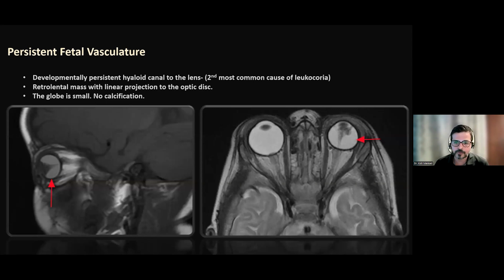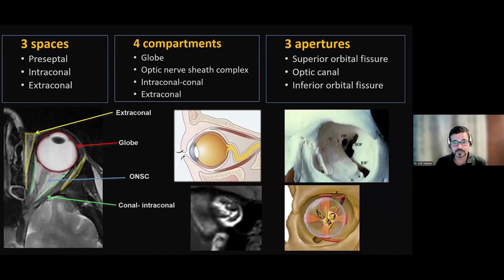This is more of your regular thing where you can have a persistent fetal vasculature just appearing as a line on a fetal scan. And you start wondering about other entities as well, but the importance of postnatal imaging is severely stressed on these. And I did tell you I have cut down my talk to keep within the time, so I'm going to pause there.